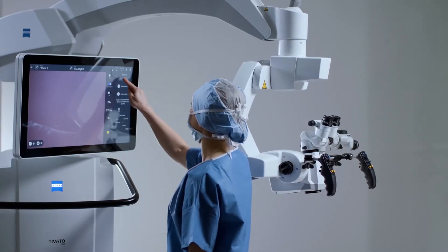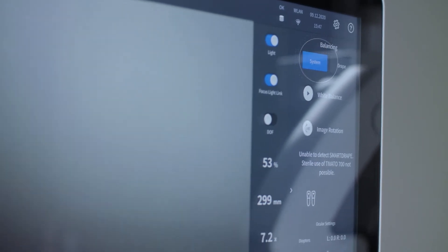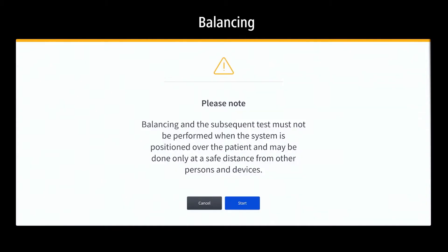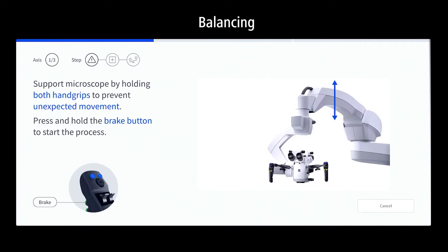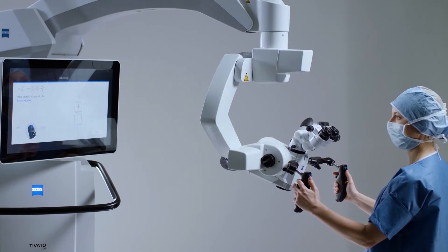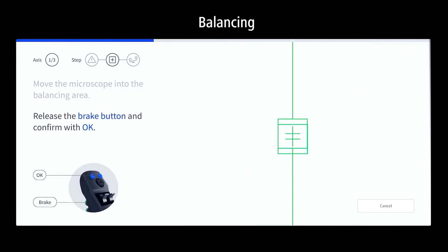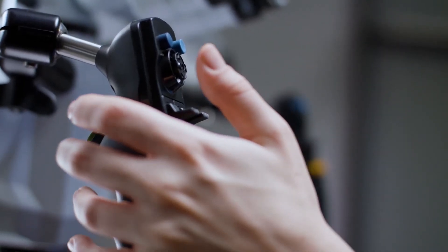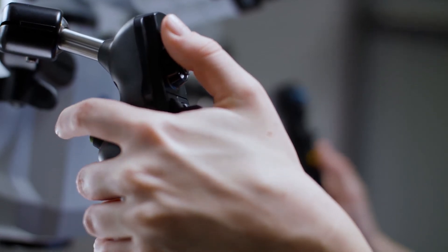Start the Guided Balance workflow from the balancing section of the main screen. Do not perform this procedure over the patient. Always read the instructions on the screen carefully. Each paragraph has one action item marked in blue. All three axes need to be balanced in three unique steps. The navigation panel always shows you the current step.